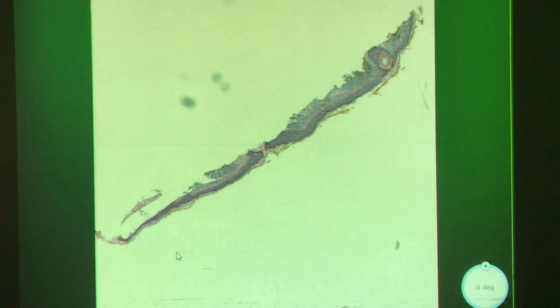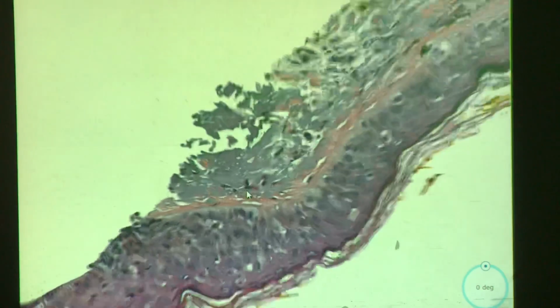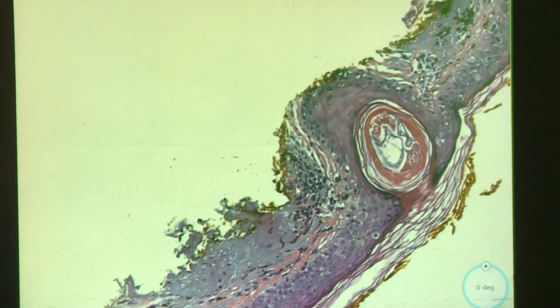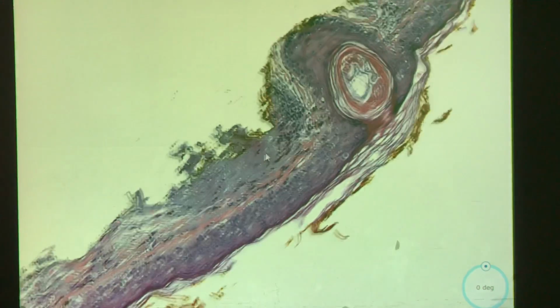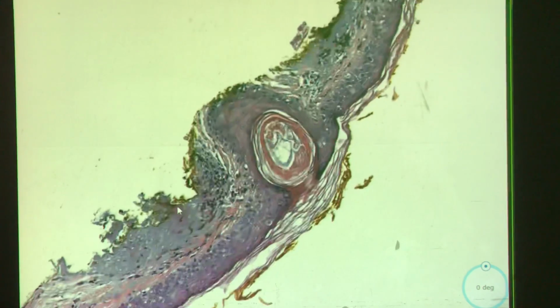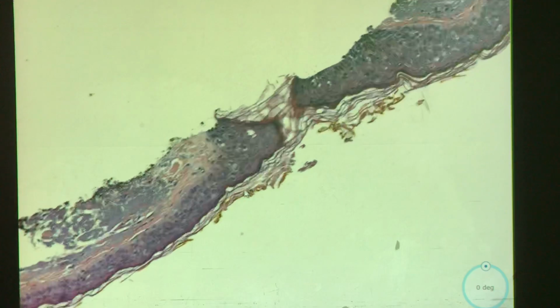A very superficial, thin strip of skin with something. Alright. Oh, that's just debris. That seems like inflammatory debris maybe. It's solar elastosis. Oh my god, that's some crazy solar elastosis. Yeah, it's just the way it's stained. It just looked like it melted, so kudos.